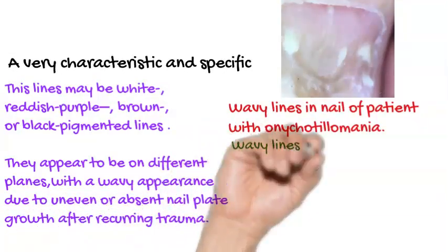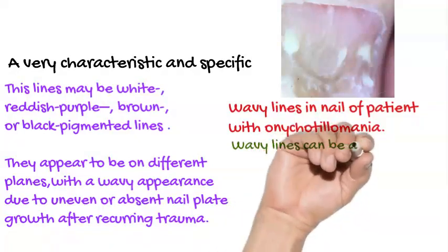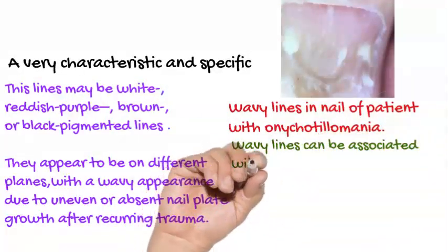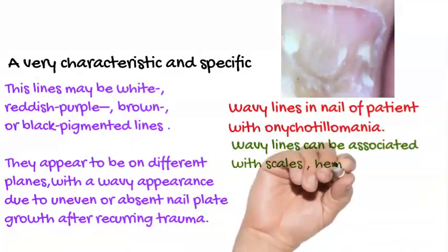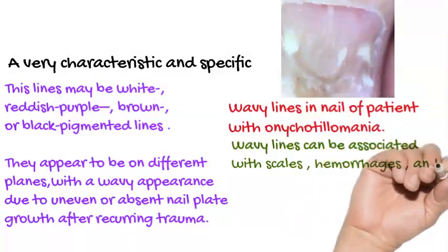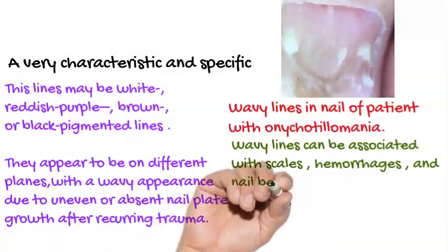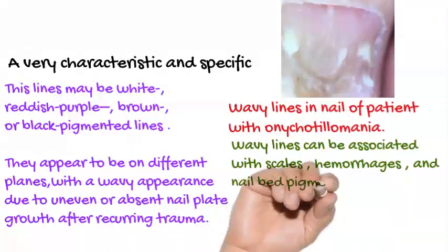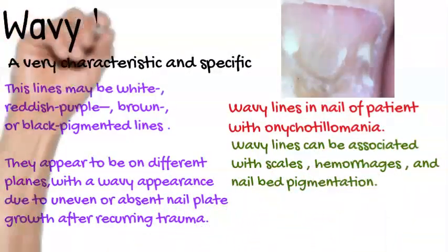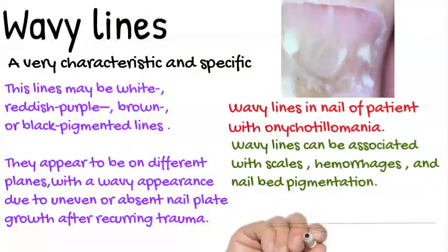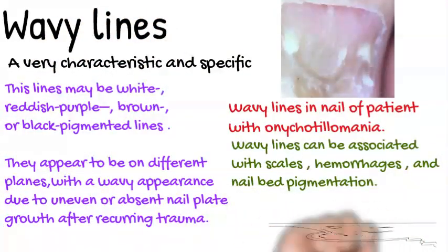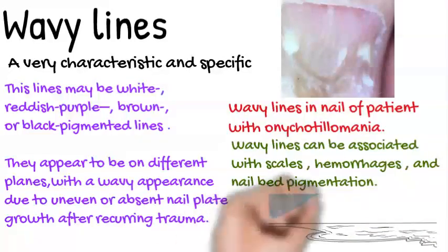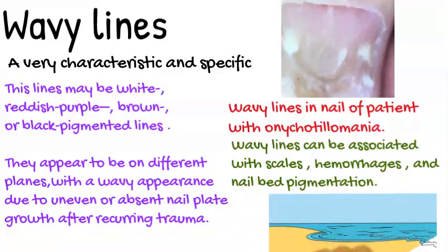These wavy lines can be associated with scales, hemorrhages, and nail bed pigmentation — or they may appear as the only criteria. Wavy lines are a very characteristic and specific criterion of onychotillomania.